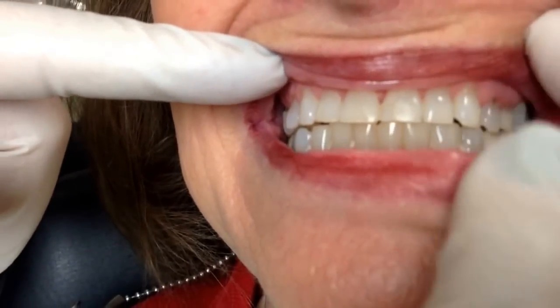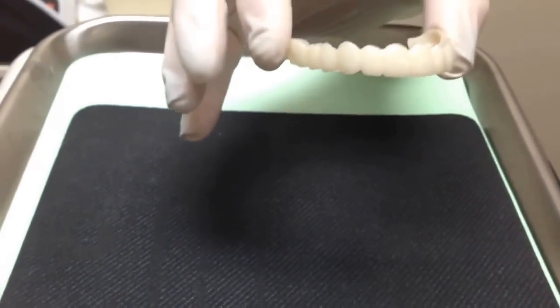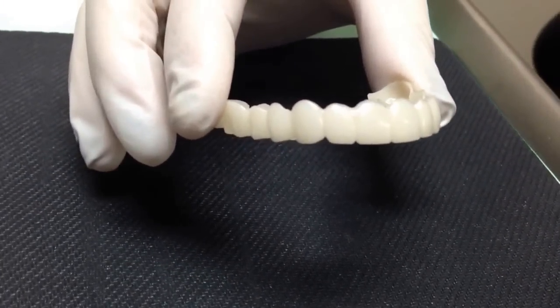Bite down for me, and you can see — smile big for me. Her teeth are just a little bit too small for her; they've been worn down over time. So we're going to get right to it. Let me show you the Snap-on Smile. We're going to go over here and look at this, and here is the appliance. As you can see, we've lengthened her teeth, and they're not all the same size.